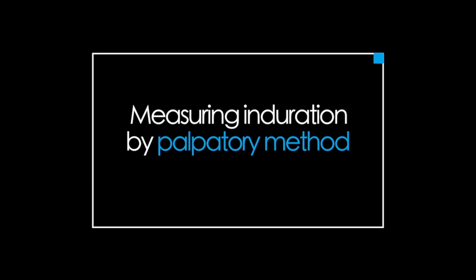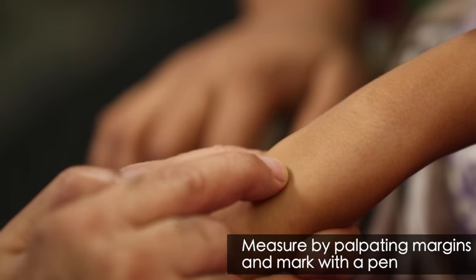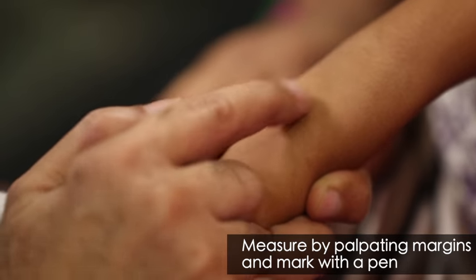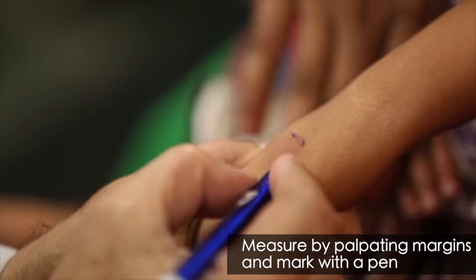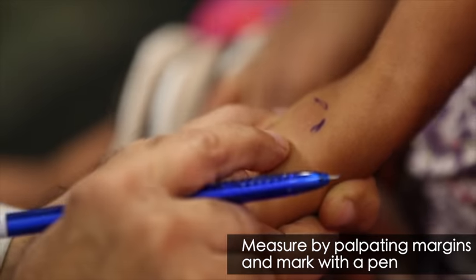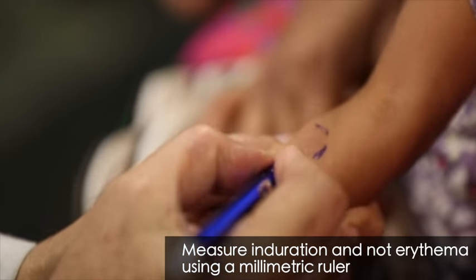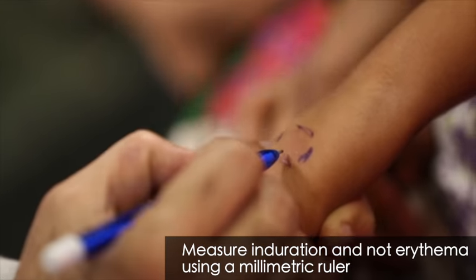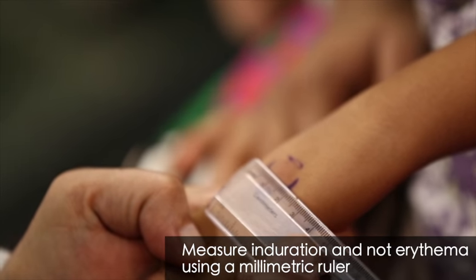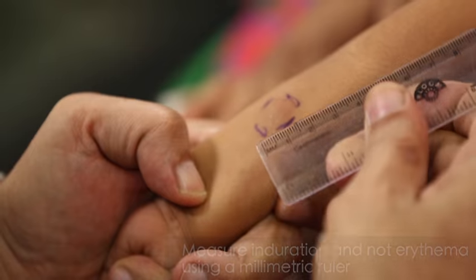Induration can be measured by the palpatory method. Here, we gently stroke the area around the injection site to identify any raised margins. The identified raised margins are then marked with a pen. The diameter of the indurated area should be measured across the forearm, perpendicular to the long axis. With a millimetric ruler, we measure only induration and not erythema.